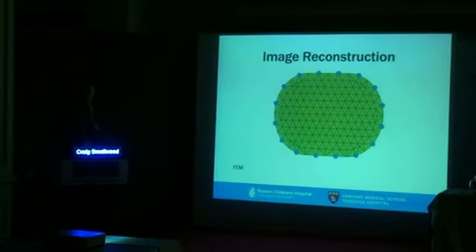So when we do the workshop this afternoon, you're not going to see this mesh. We're just going to see the end product. But I'm going to show you the various steps to get to our beautiful lung images. So we have this mesh. It's called the finite element model. It just means that you put all these triangles in here, a certain number of them.